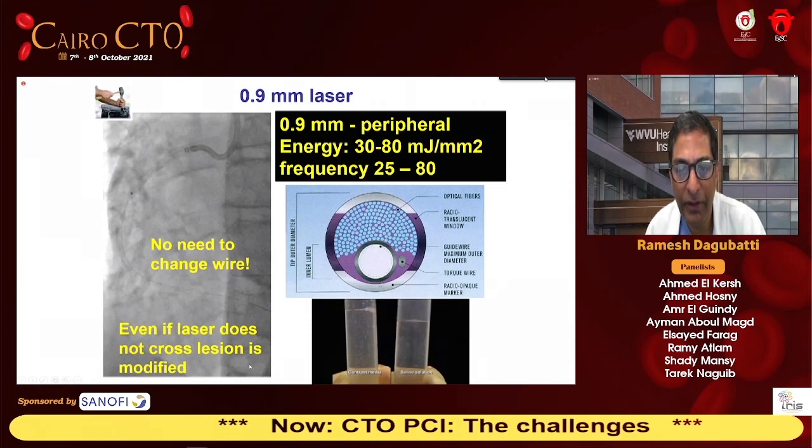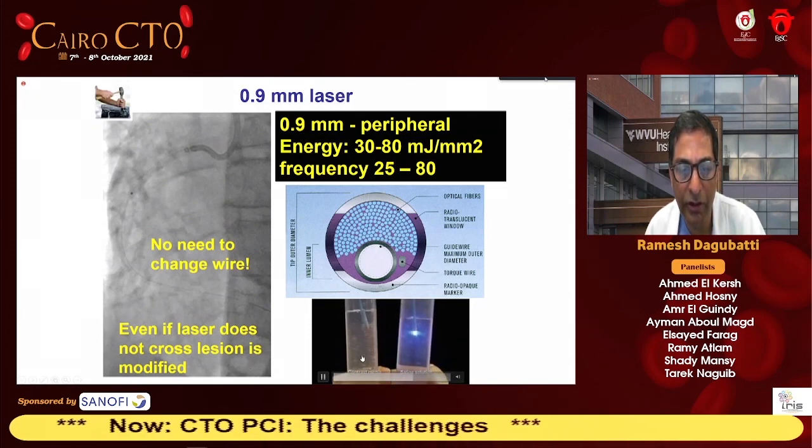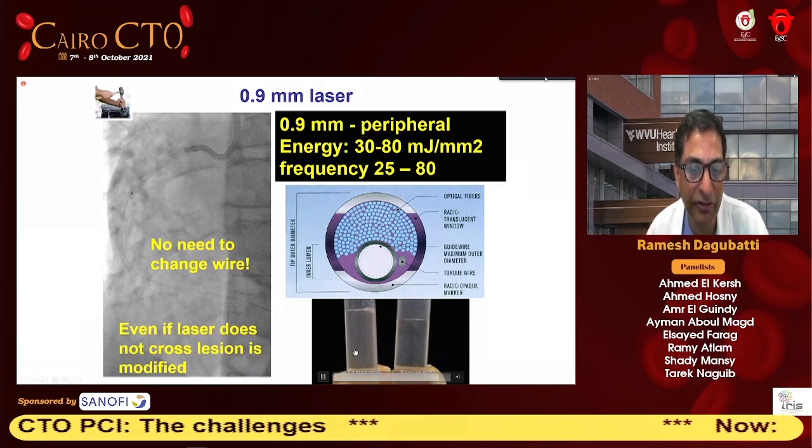I don't think there's any harm doing it in saline, but you can also use contrast. And obviously with contrast, there's a slightly higher chance of dissections and perforations.